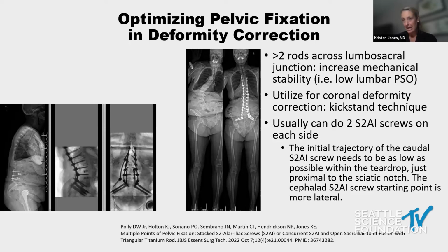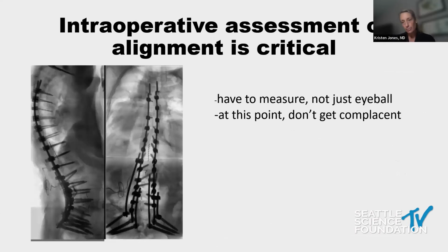So as Dr. Gupta mentioned, this does not displace the need for bone grafting, and we actually will bone graft before we put the rods in, because as he mentioned, you can't reach underneath those rods to do that very well at all. Certainly you can't decorticate very well under those rods. So you absolutely have to have meticulous bone grafting techniques the more rods that you use, because they do take up space.